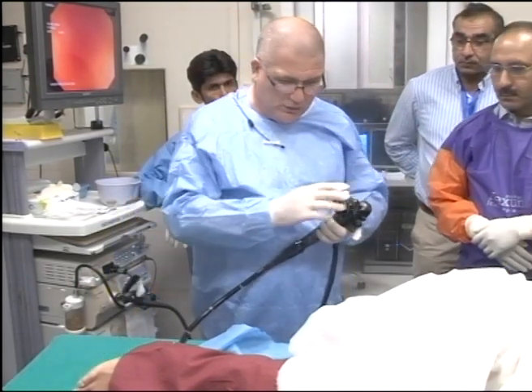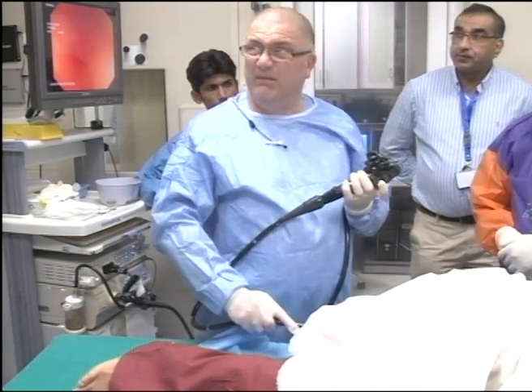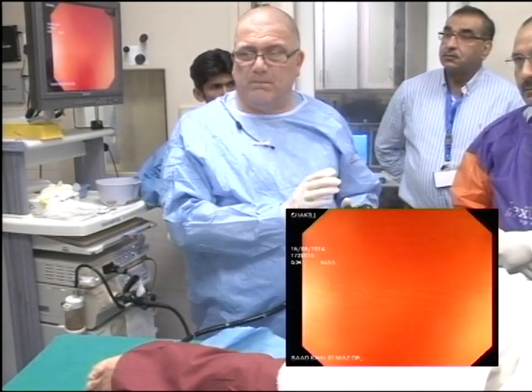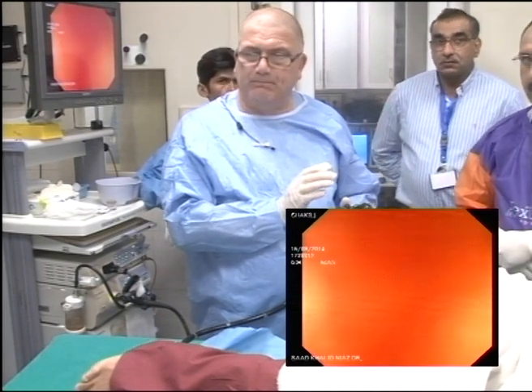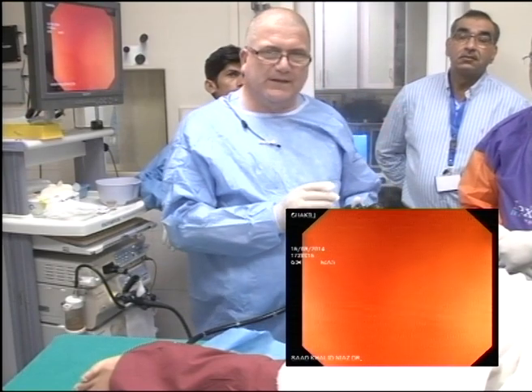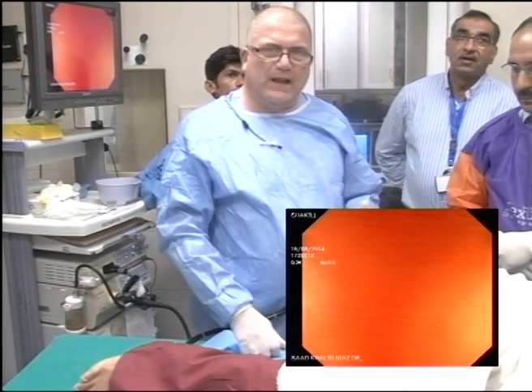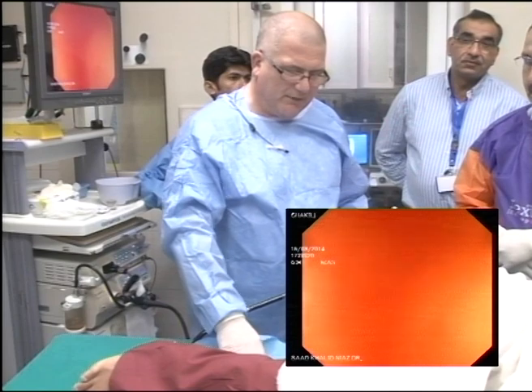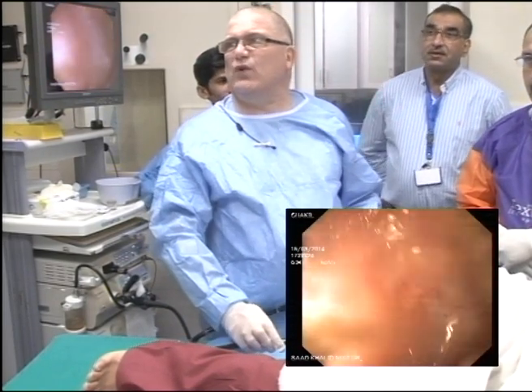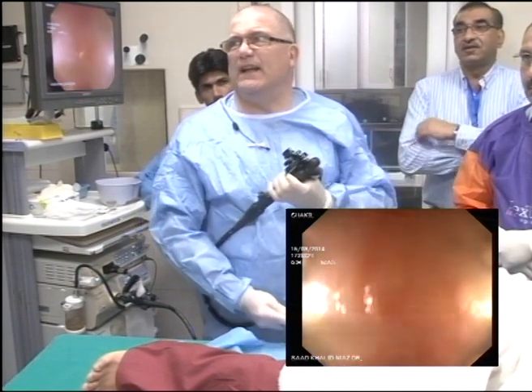They're even talking about spraying their entire colon and then continuing. I know one particular consultant doing bowel cancer screening who starts their list at 2 o'clock, 4 patients, and has still not even finished their last patient at 7:30 at night. That's 4 patients. If you think that is a good use of resources, then think again.